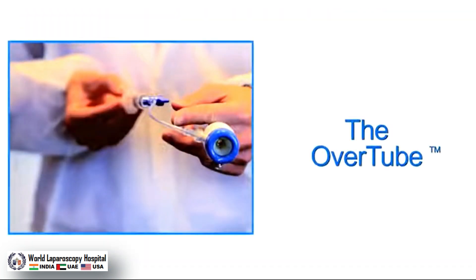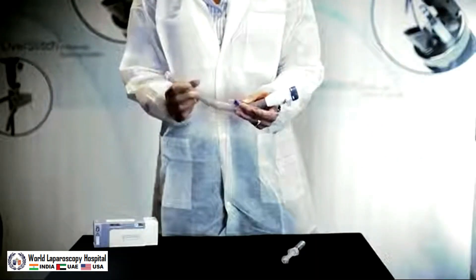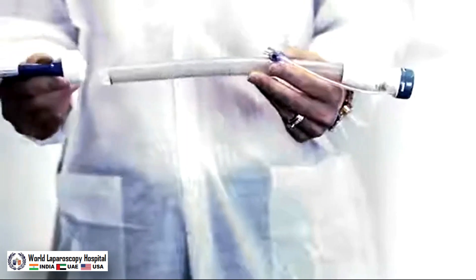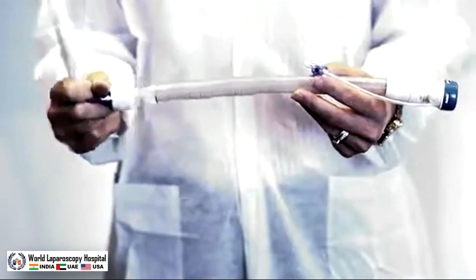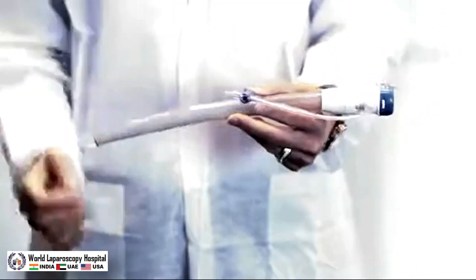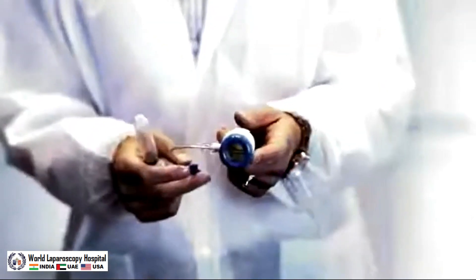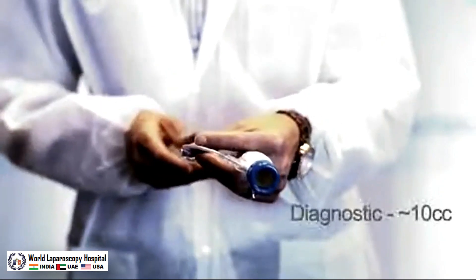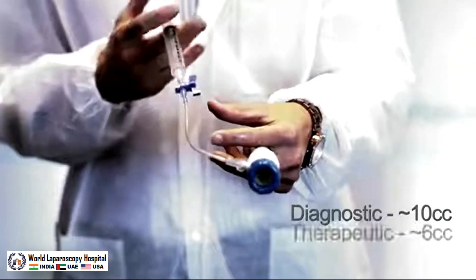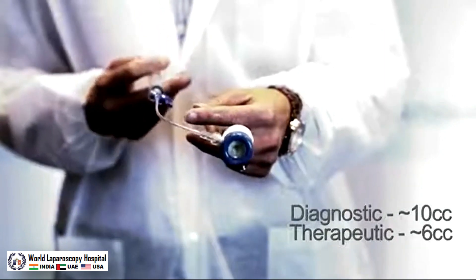The overtube is designed to protect the esophagus and maintain insufflation during advanced endoscopic procedures. The overtube has a two-layer insufflation seal. Before insertion, ample lubrication is needed at the distal and proximal tip of the overtube. The overtube's proximal cuff is key to maintaining insufflation. The cuff is inflated by attaching a 10cc syringe and injecting air. Note: for an EGD scope, inflate up to 10cc of air, and for a dual channel scope, inflate up to 6cc of air. When inserting the overtube, it must be placed over a diagnostic EGD scope or a dual channel scope.